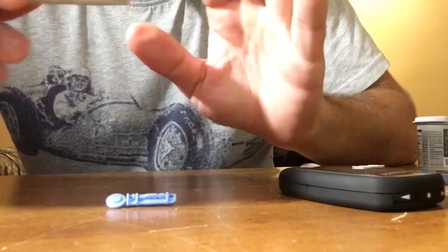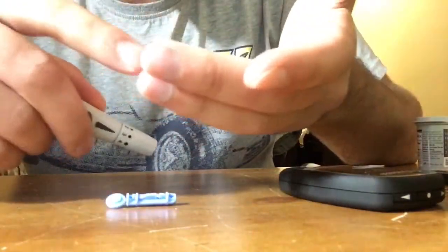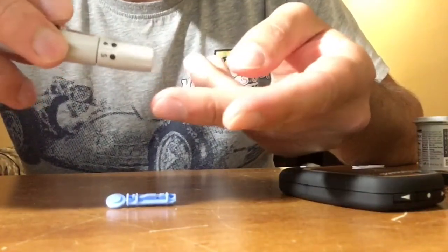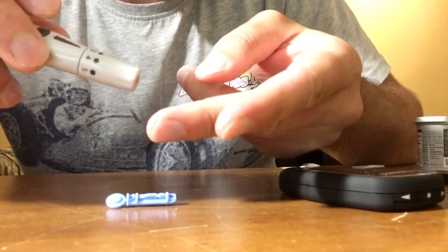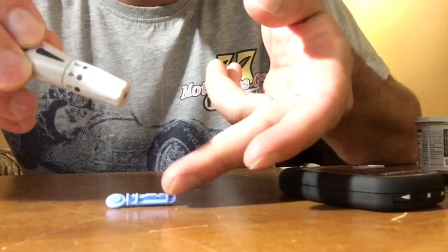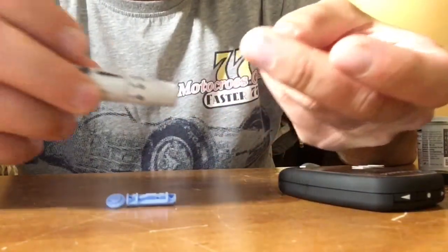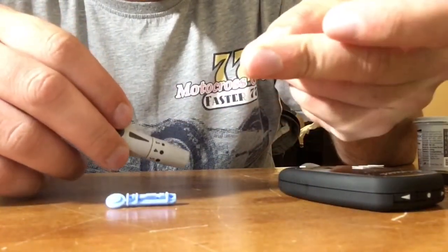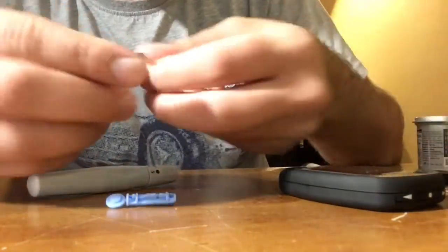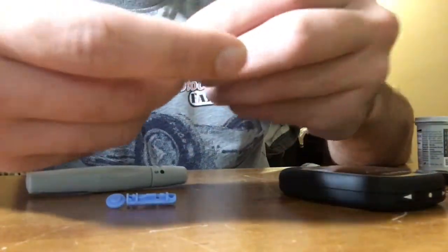You can choose whichever finger you want to take a blood sample. Once you're ready, you push this button here and the needle comes out. Then you're going to have some sample blood, and you're going to put that sample blood onto here.